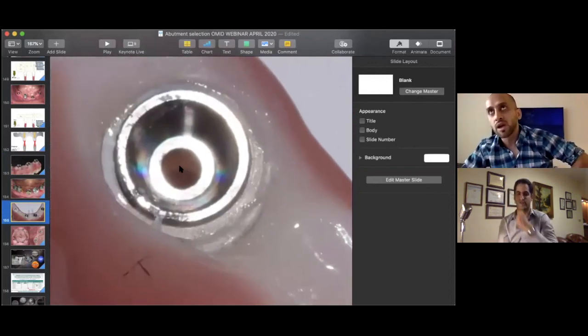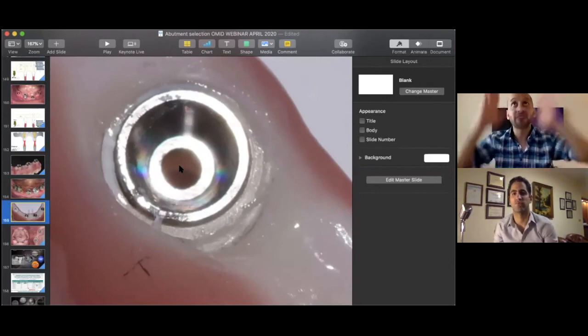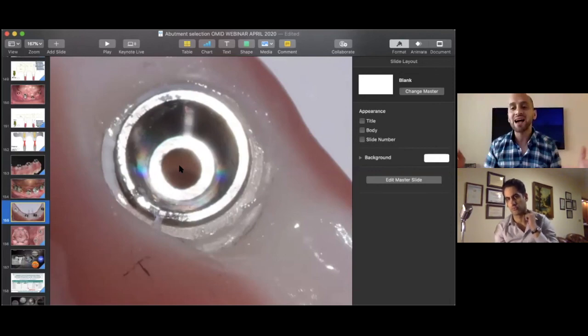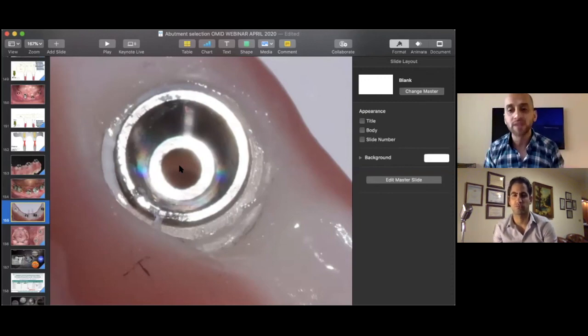So to answer your question, because we have this path of draw problem, should we do them segmentally? Yes, you can do that, but that also depends on the number of implants. If you have an all on eight or all on six, yes, you may be able to do that. But if you have an all on four, that protocol changes. The all on four protocol does not call for segmentation. So it really depends on what's your modality of implant treatment.